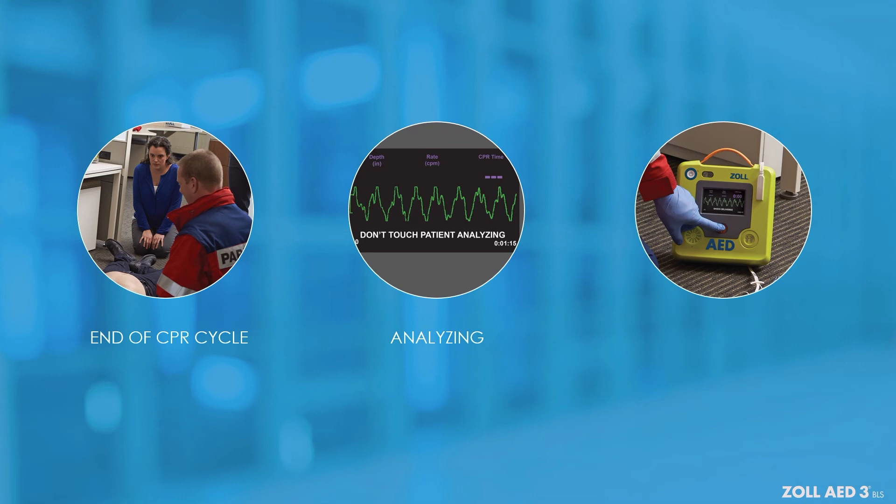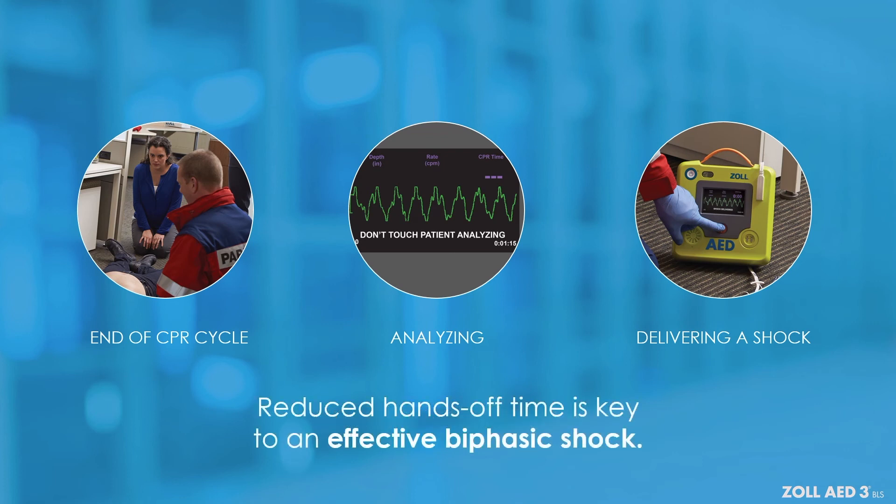The time from stopping CPR to delivering a shock, known as the pre-shock pause, can be as brief as 8 seconds. Providing a reduced hands-off time means an increase of CPR fraction, which is key to an effective biphasic shock.